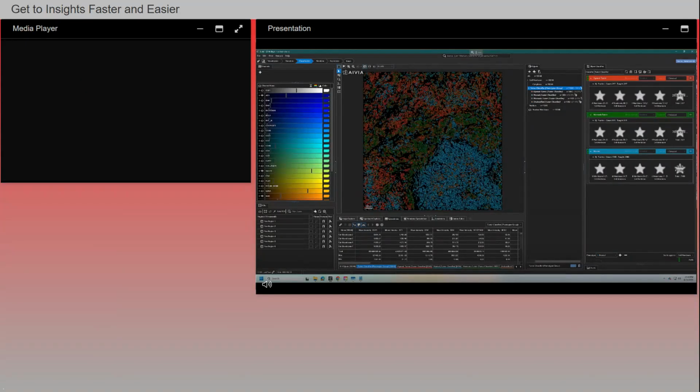We can take this section, for example, and apply an automatic classifier to make new discoveries, or we can train a new classifier set with different intensity or morphological measurements. This is indeed a playground for you to explore data using whatever characteristics you are looking for, in the case of supervised classification as I've shown you, or for true discovery, you can have your data guide you and explore.